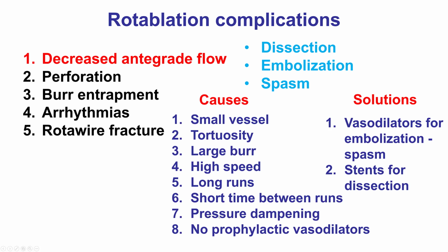Also, if there is a dampened pressure waveform on the guide, there can be reduced antegrade flow that can predispose to plugging of the microvasculature, and also not giving prophylactic vasodilators. In our lab, we routinely give 100 to 200 mics of nicardipine, which has a long duration of action, as well as less hypotensive effect than other vasodilators.